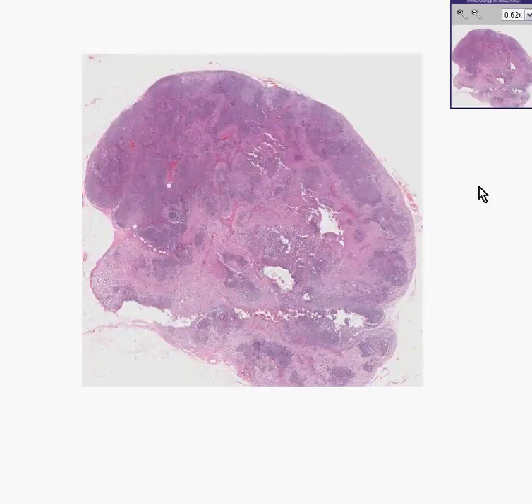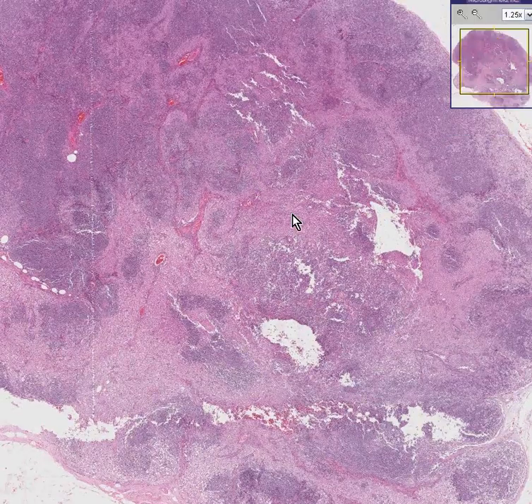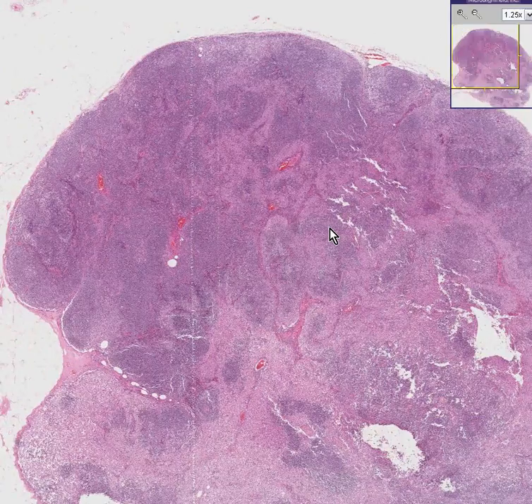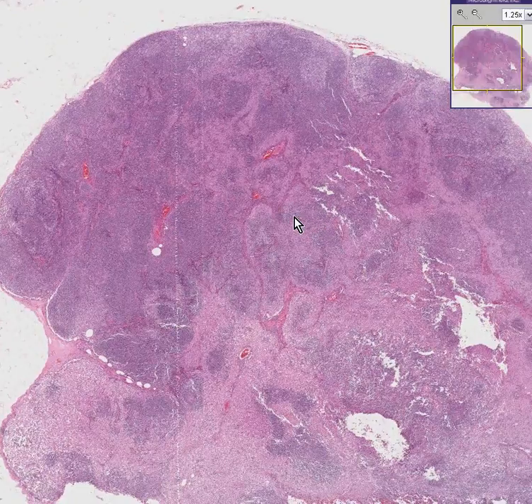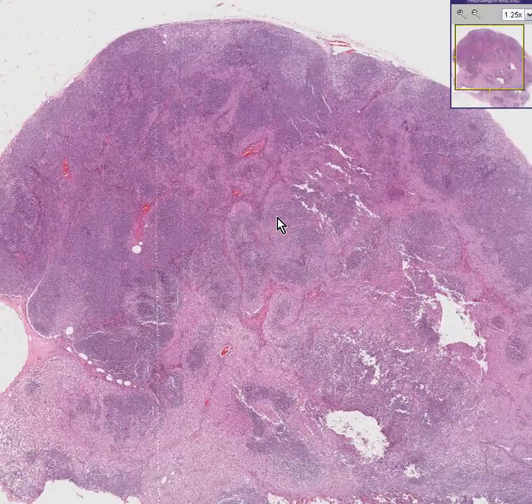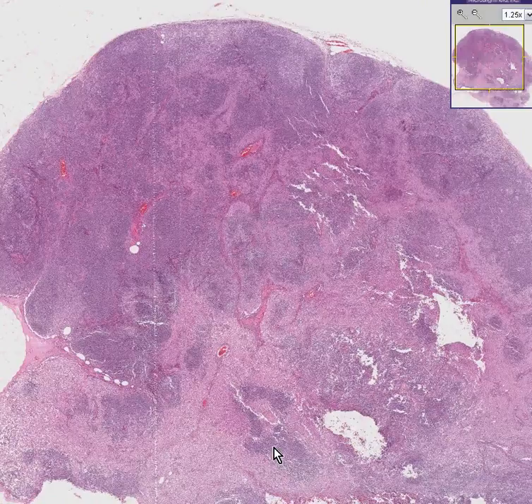This slide brings up a very crucially important concept in lymph node pathology and lymphomas in general. Remember, we've already said a million times that in order to diagnose a lymphoma, you need effacement of a lymph node. Well, I should have said 100% effacement, because yes, sometimes in very early stages, if you're lucky, perhaps only part of a lymph node is lymphoma, but for all practical purposes, 90-something% of the time, the whole lymph node is destroyed in a lymphoma, or effaced, I should say.